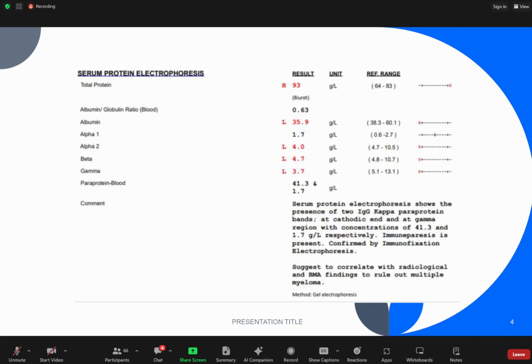So I wonder whether it is due to different clones of cells. Yeah, it's possible, because one may be coming from the plasma cell, whereas another came from the abnormal B cell. Whereas the last time when I presented the case with two lymphomas, one expressed kappa and another expressed lambda, so different light chain restriction. But in this case, both are expressing kappa.